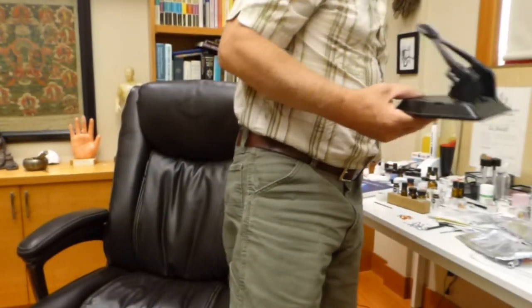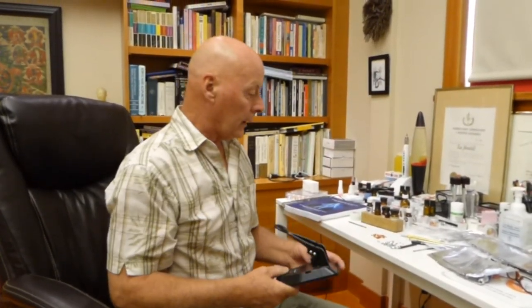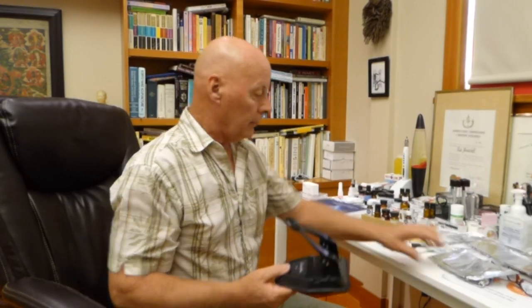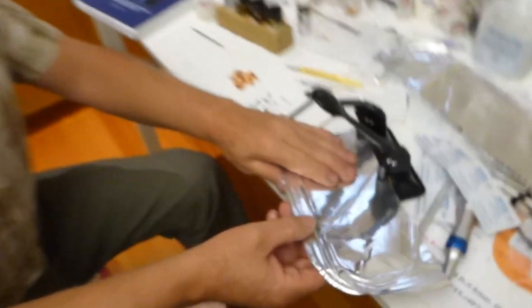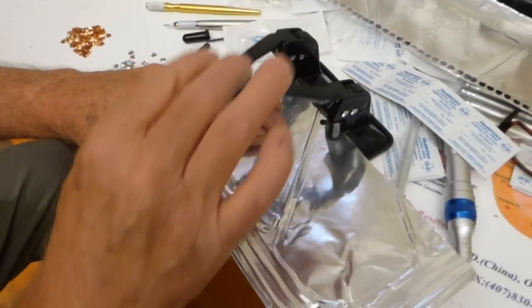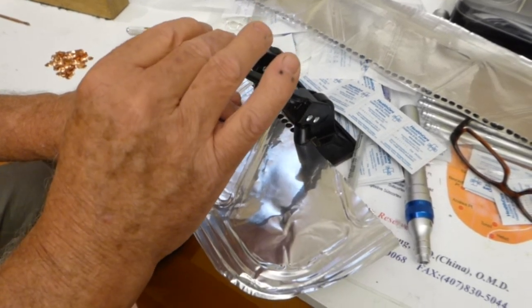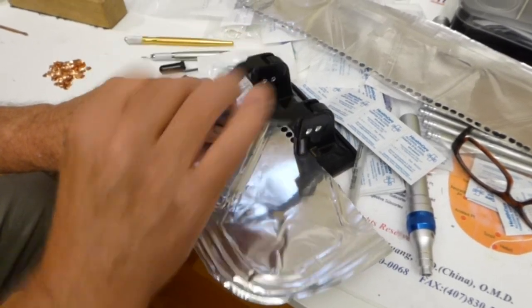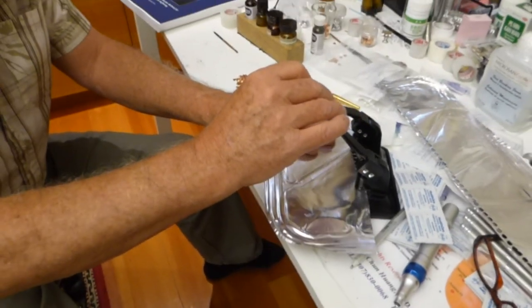Let me just demonstrate how I do this — anybody can do this. I don't care if you're in Kathmandu or in Bombay, they've got aluminum everywhere. You can find a hole punch, whether it's this one or some other brand. And I just simply move along like this, and I can whack these things out by the hundreds within a very short period of time.